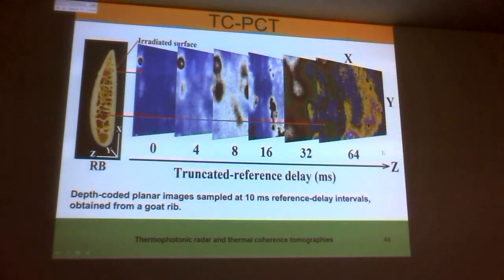But of course, this is diffusion again, so you're not going to be picking up all of the details of the trabecular. You're going to be picking up something that will be commensurate with the thermal wavelength. You're going to see the general features of the trabecular bone, but you're not going to be able to see the individual holes. This will take you to too high a frequency, which means that you won't be able to penetrate the cortical bone. However, this could be good enough because you can do statistics.